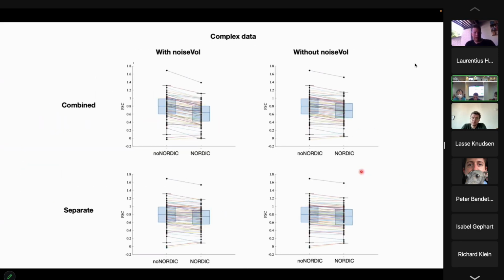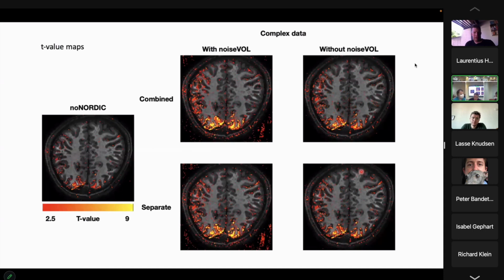Yeah. So to compute these T values, we did a second level analysis of the percent signal change. It's not the average of the T maps, but rather a second level analysis on individual trials, and that is in order to avoid the temporal correlation. That actually relates to, I don't know if it's Daniel who is on the screen, your question regarding the correlation.